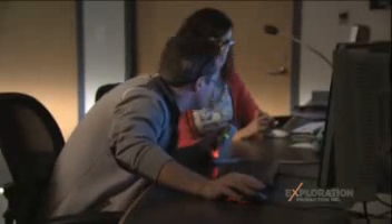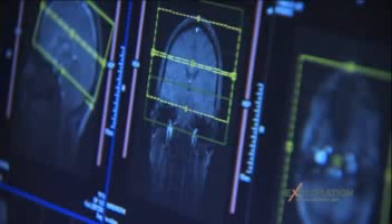This is an fMRI — a functional MRI — that will actually pinpoint changes in blood flow inside my brain. What we can do with that is determine which areas of the brain are active while a patient may be thinking of something or talking. The changes in blood flow happen at such a small scale that you can actually localize areas of the brain that are active.